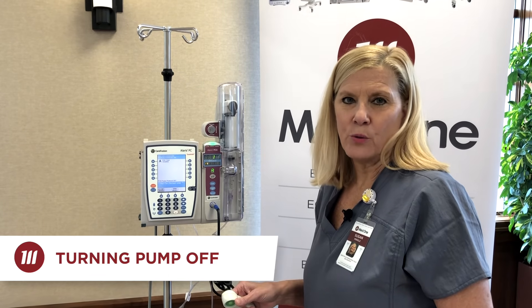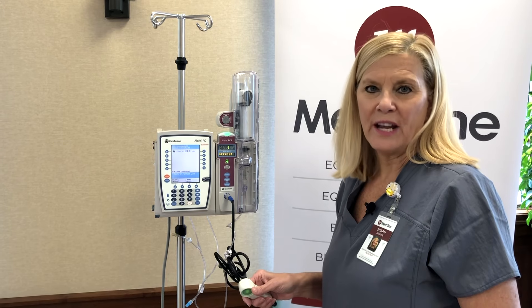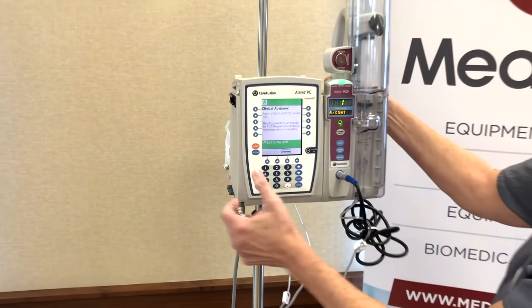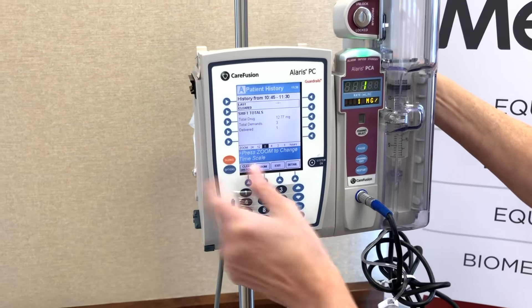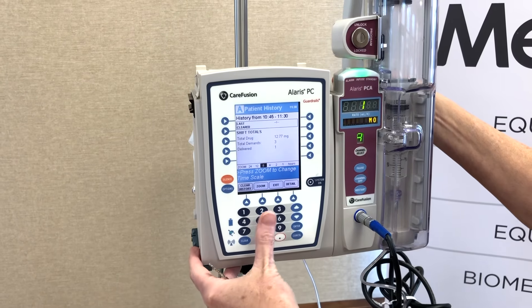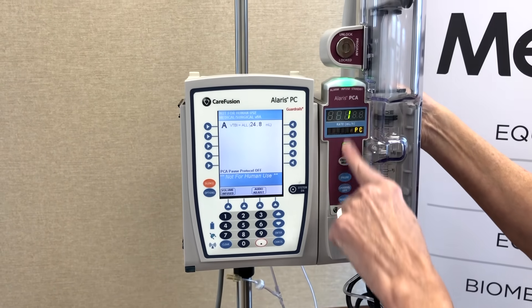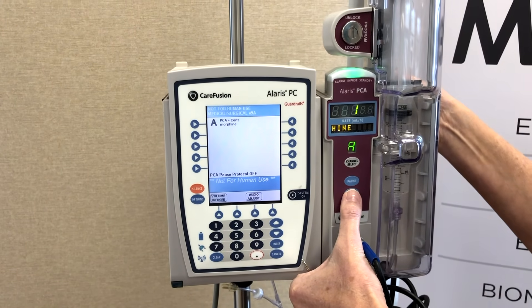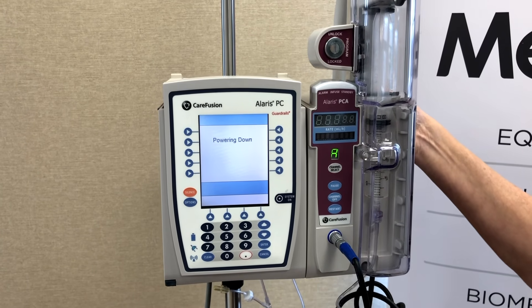Your patient has been given discharge orders and you're ready to turn the PCA device off. First, make sure you check your history so you can document that prior to discontinuing — channel select, options, patient history. You'll have a total of all the history for that patient so you can chart it before discontinuing the device. Once that's done, exit out, and then on the PCA module itself, press and hold the channel off button until you hear a little chirp. Let go and you've powered down your PCA.